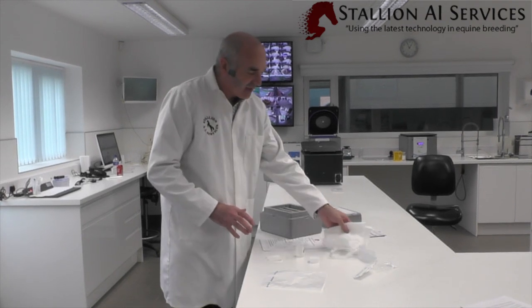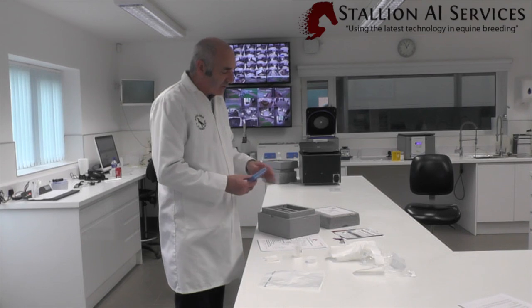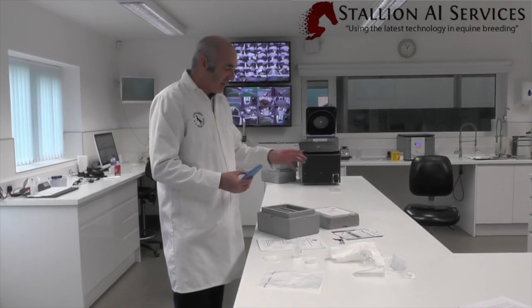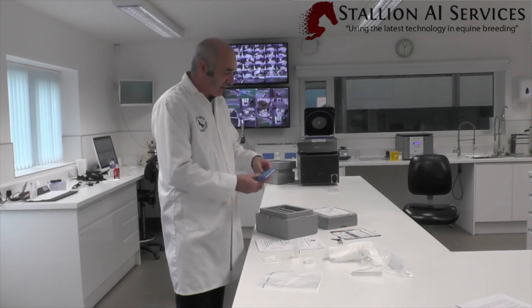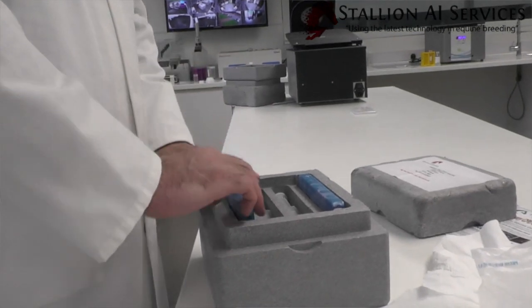It's only at this stage that we actually put our ice packs in. We want the semen to cool down as slowly as possible, so we don't want to pre-cool the box down. We get the ice packs out of the freezer, place them into our polystyrene box, and then we add the paperwork.